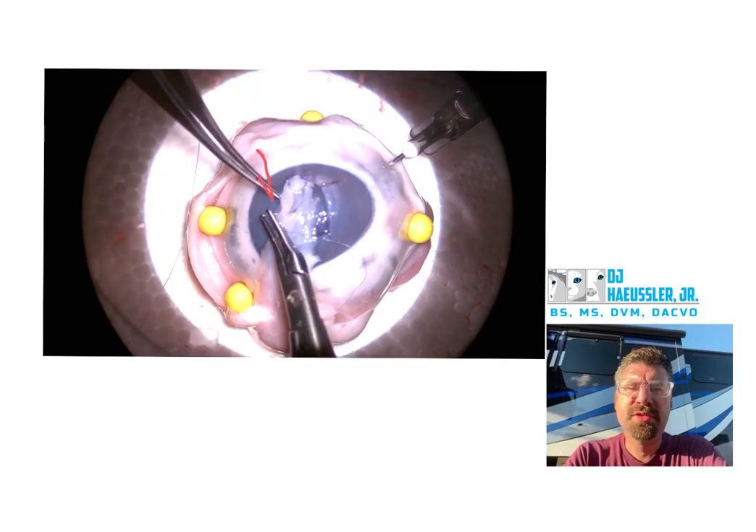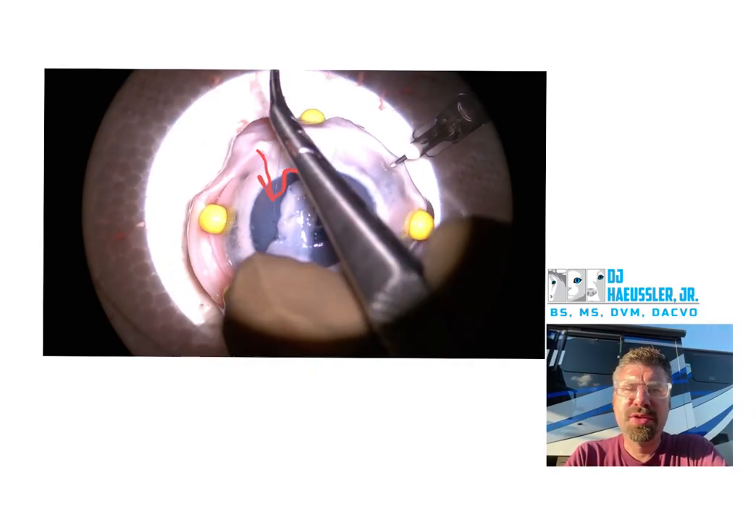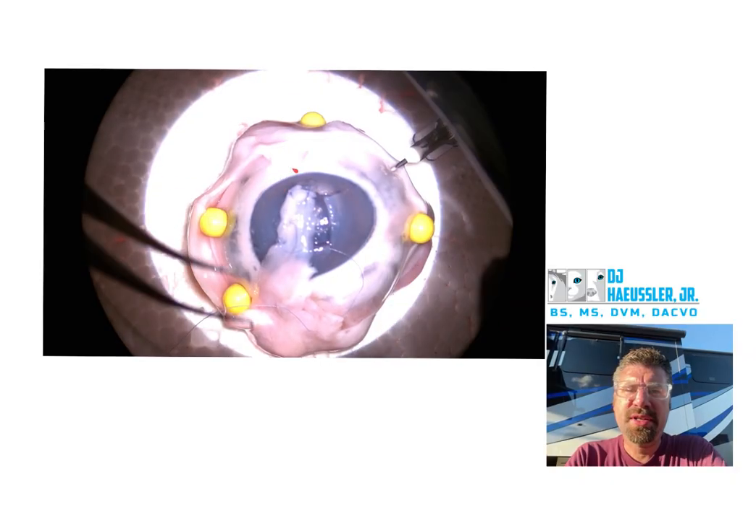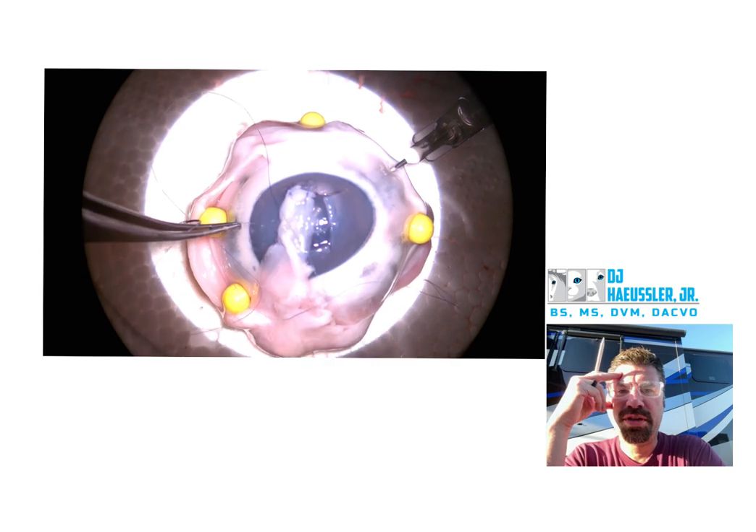Still have a bit too much Tenon's all the way through there, so in the future you'll want to get some of that out. I realize some of this is just from pig eyes and things like that, but something to focus on.